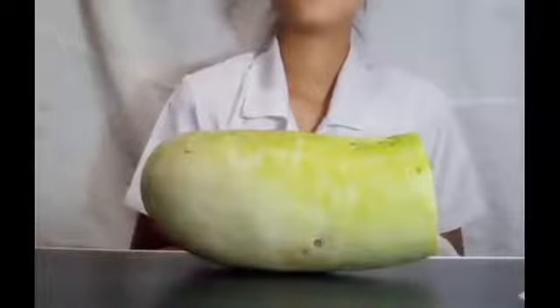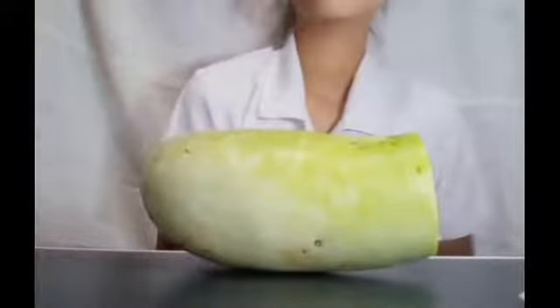Next, for the subcutaneous injection. For this example, I have here also a 1 ml syringe, or the insulin, because that's actually a very common subcutaneous injection that you will give. So we're just going to use the insulin for this, just to pretend. Because we're using the insulin, I have what we call the insulin syringe.